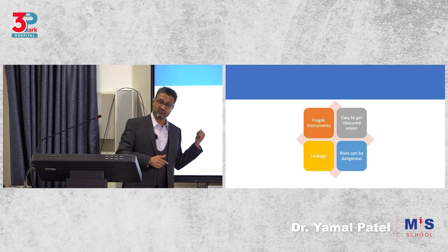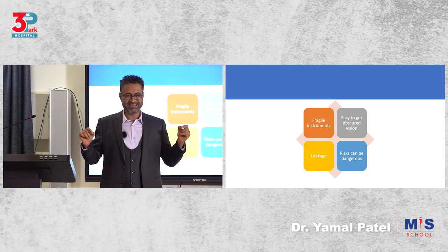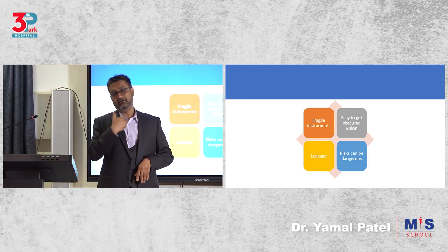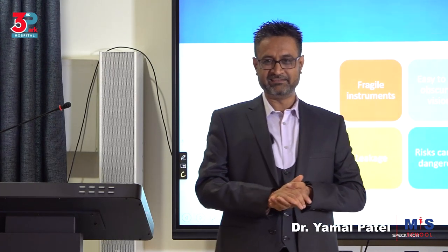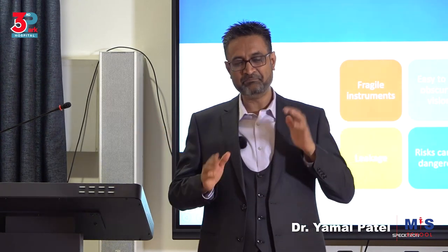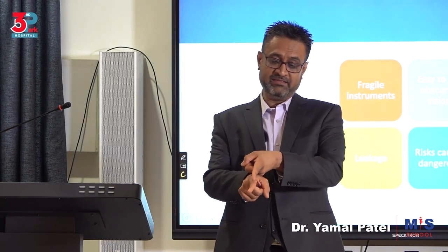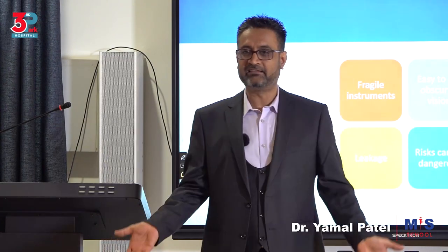Remember, they are fragile instruments. The scopes are tiny, thin, 2.9. The instruments are 5 French, 1.6 millimeters. I've had a workshop where I had a couple of delegates, and in less than 10 minutes, 3 scissors were broken, in training. The simple reason was how they were handled. When you're going in this way, and then you're trying to hold the scissors that way, you're bending it. It breaks immediately.